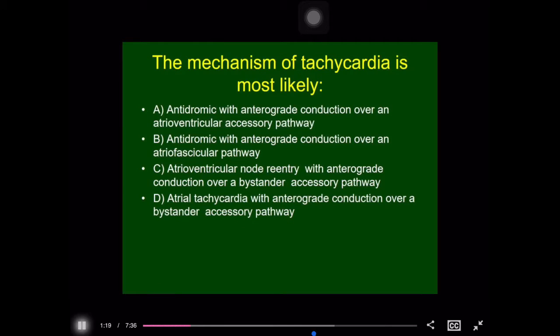The mechanism of tachycardia is most likely, and these are a bit long answers, but I want to make sure we get all the physiology in. Choice A is an antidromic tachycardia with anterograde conduction over an atrioventricular accessory pathway.